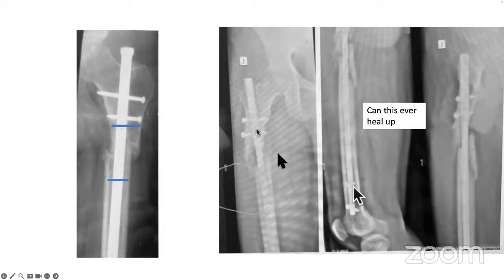You can see this is the same factor. On day one, add up: here you add up nail, here you add up plate, here you add up plate. Then you have the best chance for healing up this fracture. You may not do a graft on day one, but adding up a plate in such a comminuted or osteoporotic fracture, I feel, is going to be a security. There is no harm in doing that.